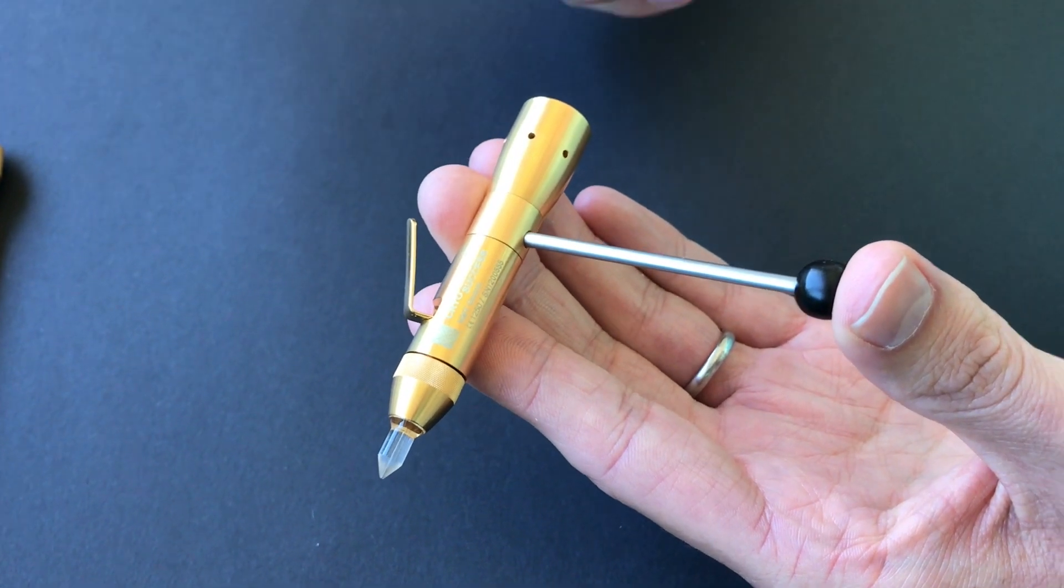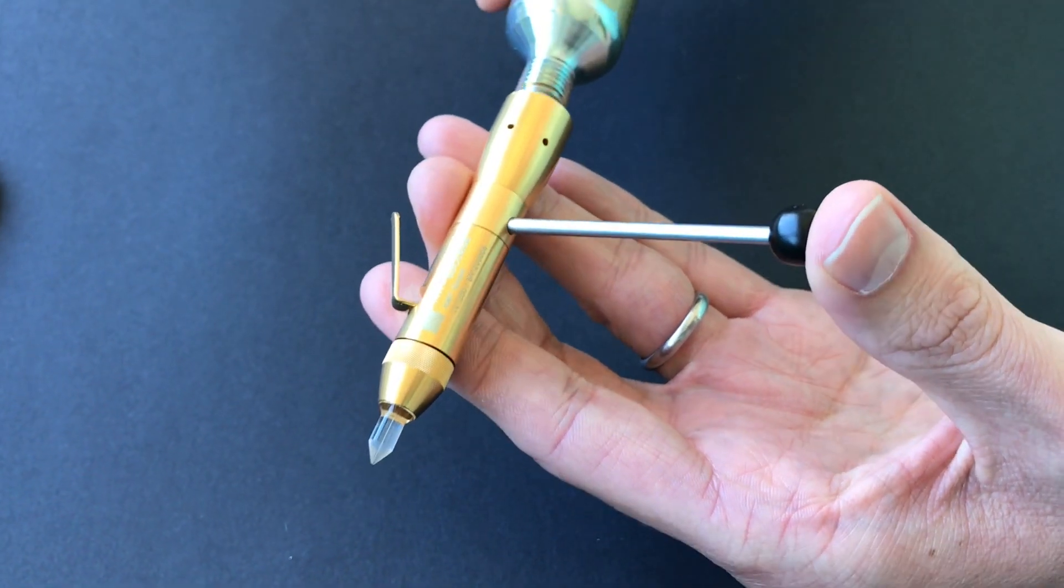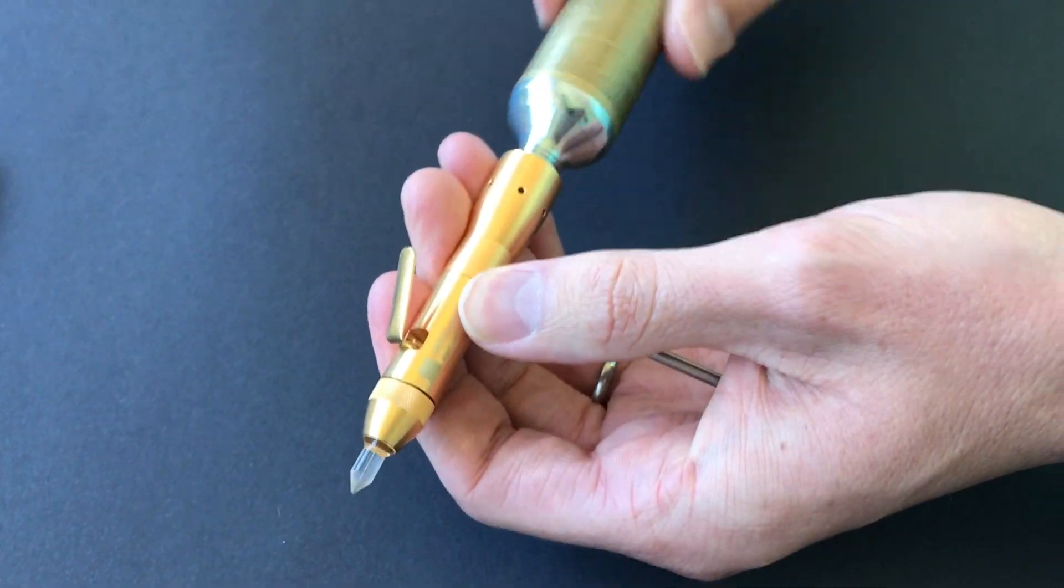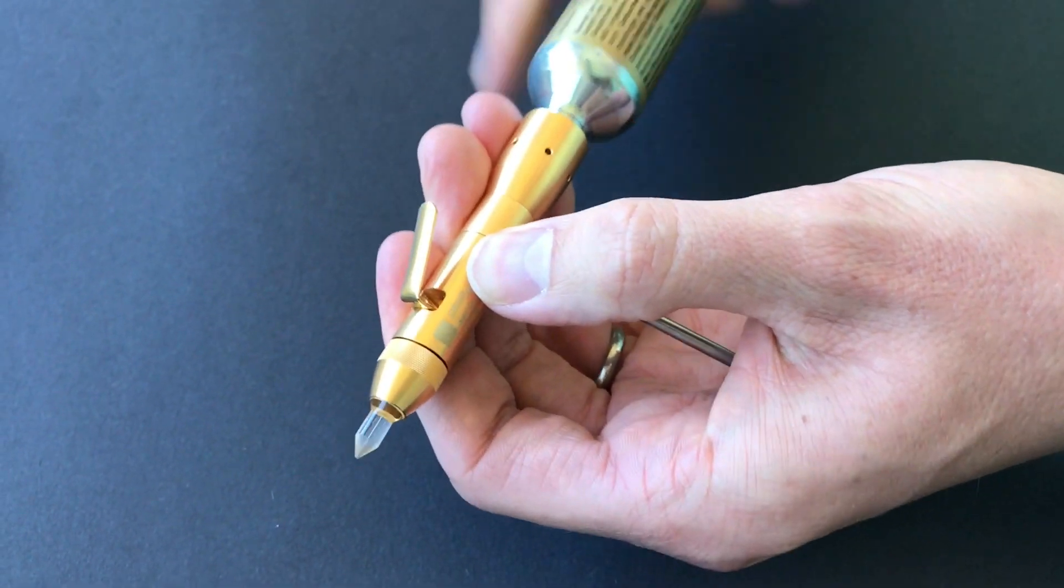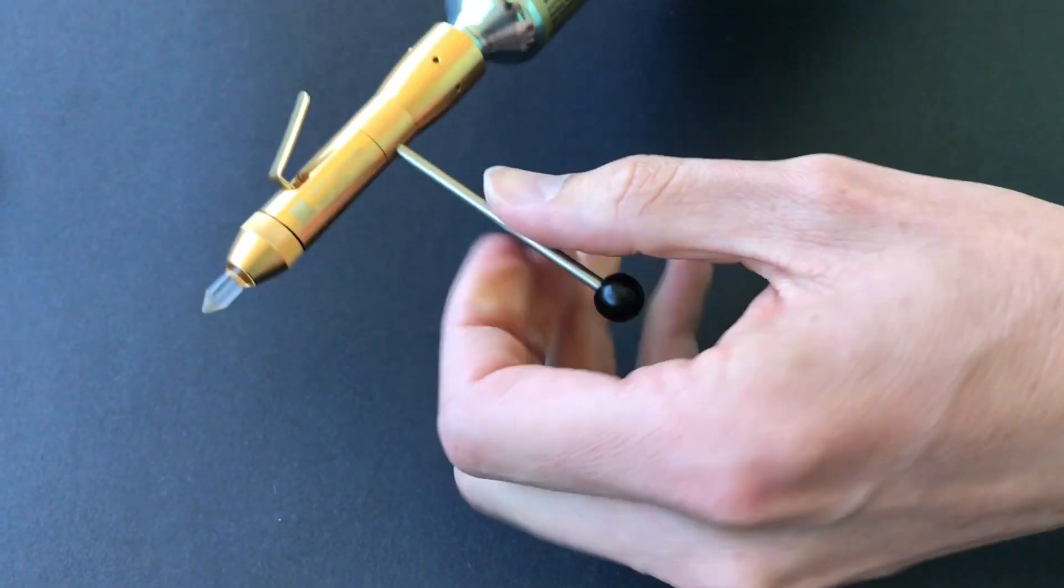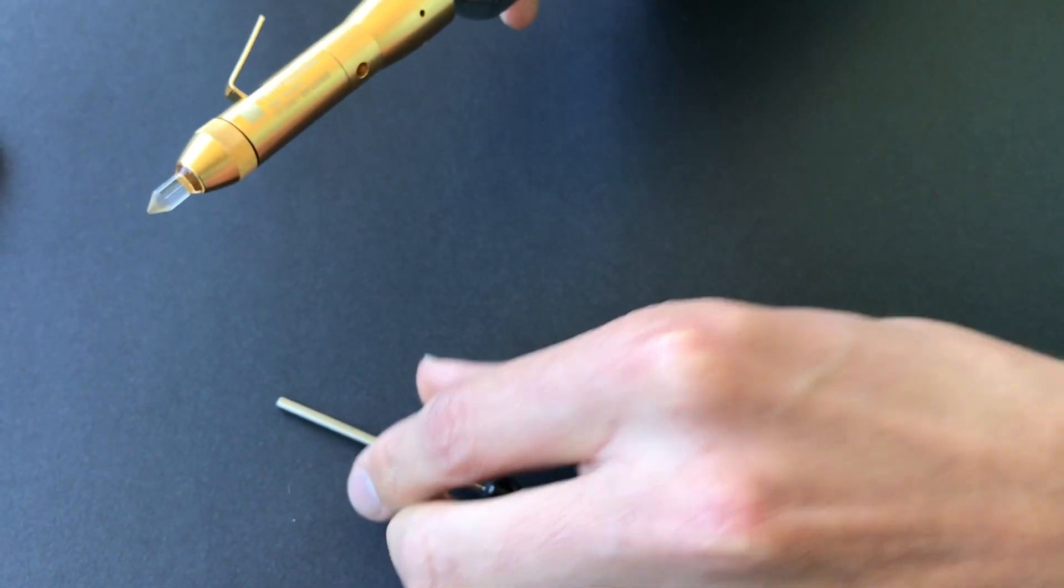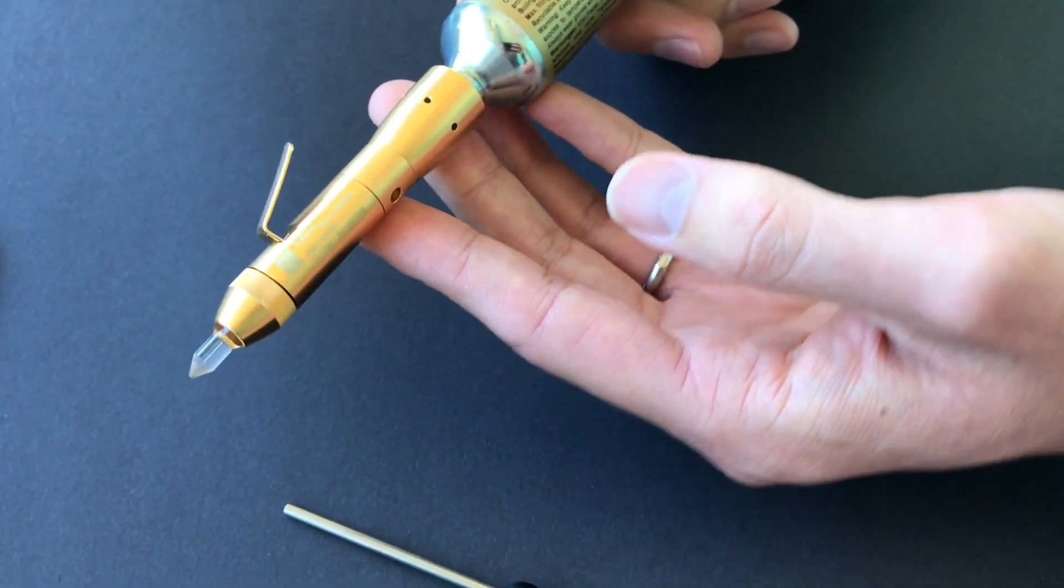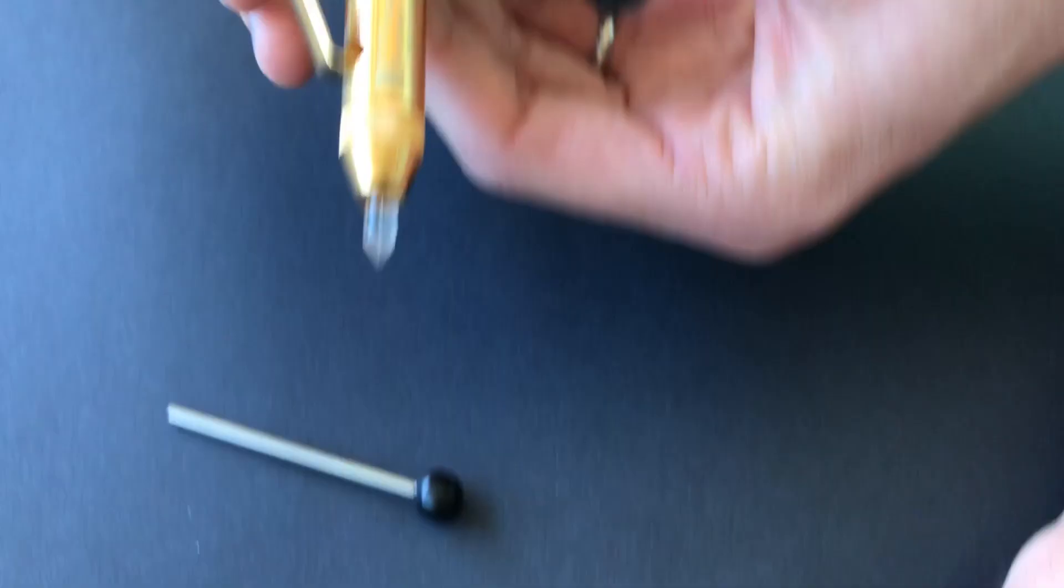With firm pressure, twist the cryotherapy cylinder in until you can't twist any further. Then remove the metal pin, and now the unit is ready to be used for treatment of a lesion.